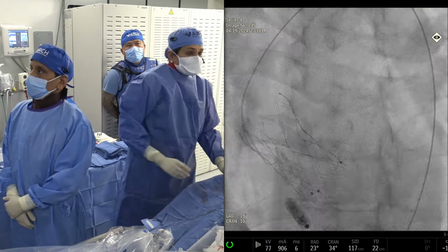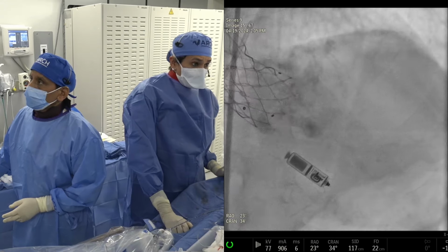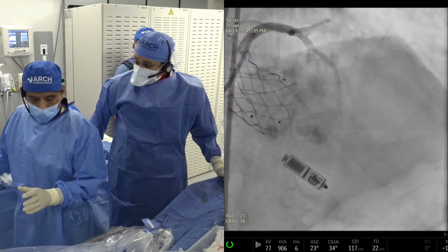Okay, if you can go here. So this was a dry cine showing tram track calcium in the LAD and the diagonal. And here we are. So about 90-95% diagonal. At the level of the first septal, you can see like a filling defect. We know this has been there even before. Could be a calcific nodule, could be just an eccentric plaque, but then definitely you have moderate disease in the LAD. And the diagonal has clearly progressed.